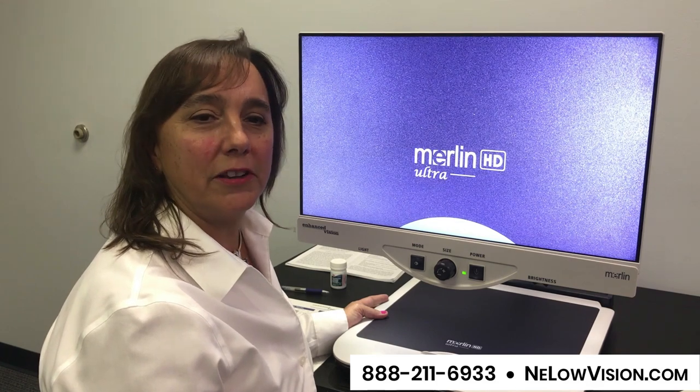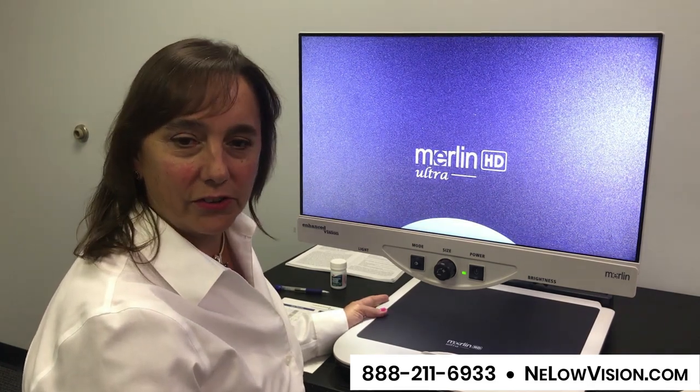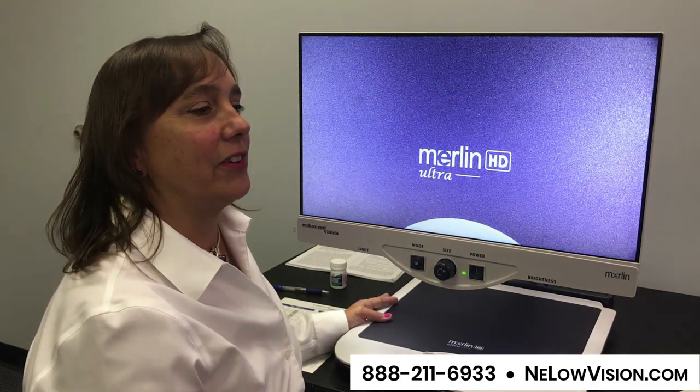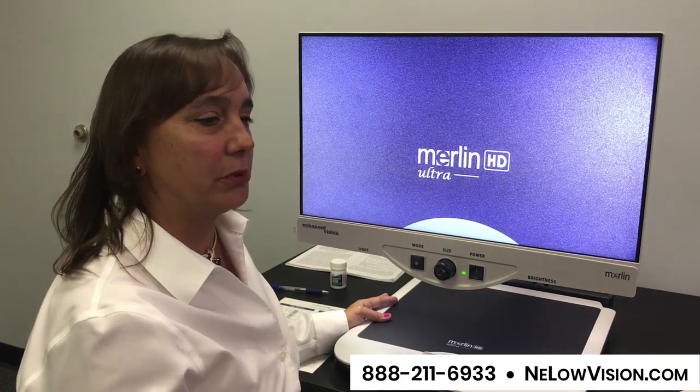Hi, I'm Tracy Andrews with New England Low Vision and Blindness. I'm excited to show you the Merlin Ultra 24 today by Enhanced Vision. This video magnifier you're going to see all over the place — it is the industry workhorse. It is very simple to operate.